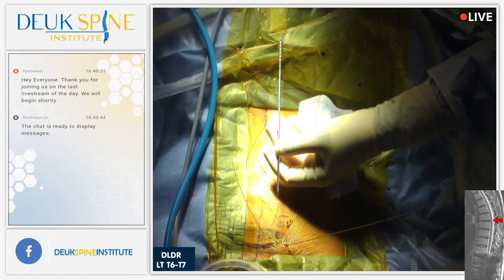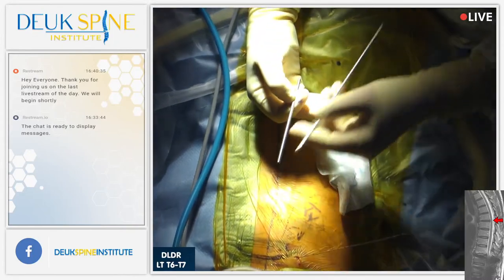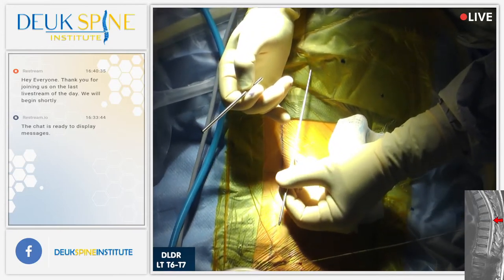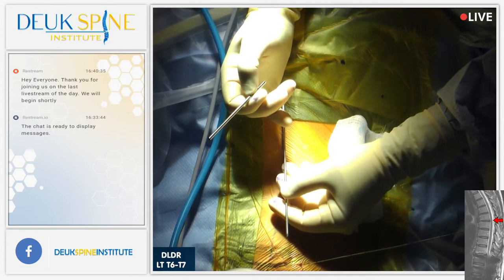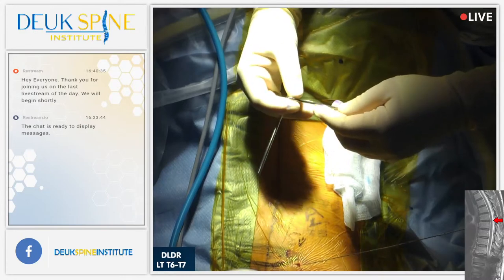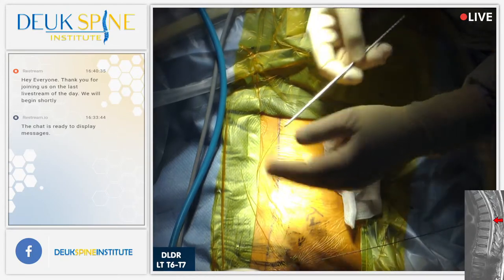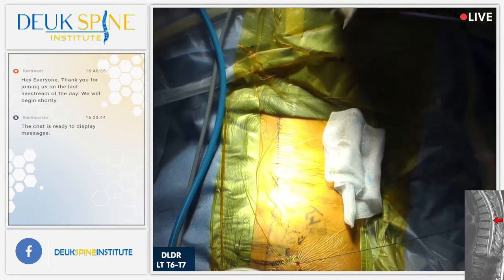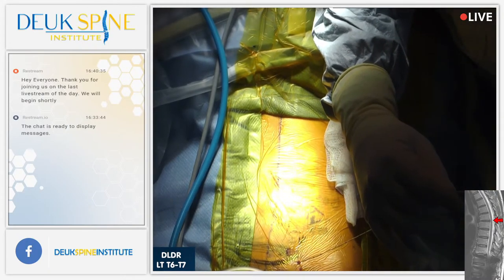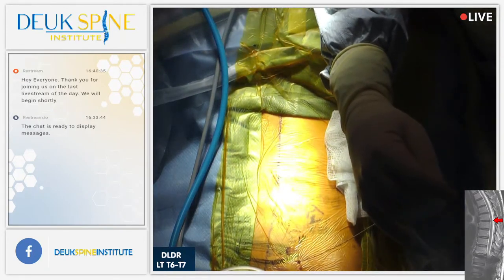So this whole surgery to repair the thoracic herniation is going to be done with this tube. This is 4 millimeters wide. This dilator is about 3 millimeters, 2.8 millimeters wide. We're going to place the dilator first, which will spread the muscle fibers open. Then we bring the tube down on top of the dilator, and the tube will go in. We'll take the dilator out. Any questions? No current questions. Let's show the video as to how a herniated disc causes back pain. Use the lumbar one.